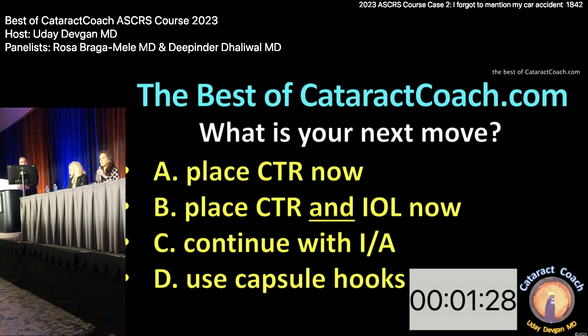Don't just plow ahead with the I/A. This time I heard your voice in my head — I'm going to do it the right way. I'd continue with I/A and try to get all of that out, but if you visco dissected it out mostly it should just fly up and forward. This is where you have to do a very gentle removal of the viscoelastic — lower your flow rate, go slow, take more time to remove it.